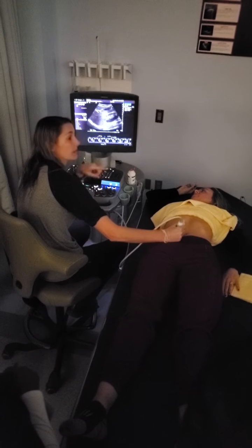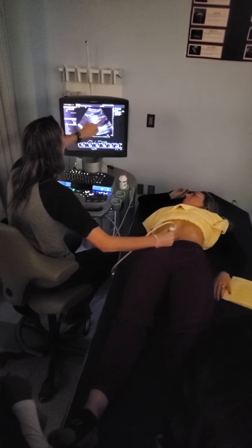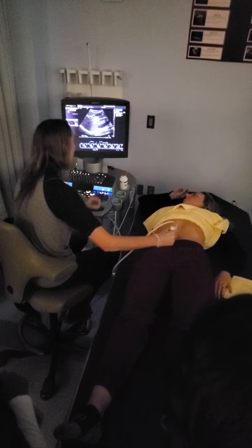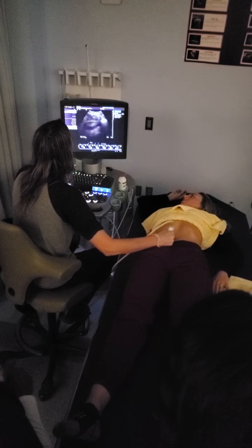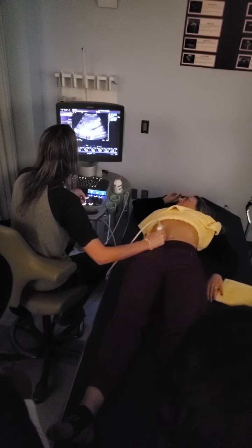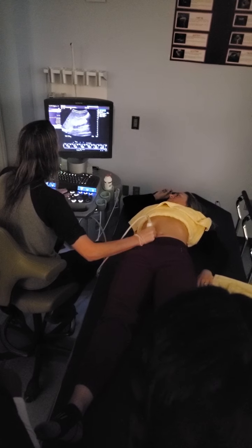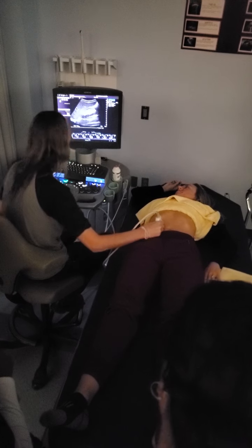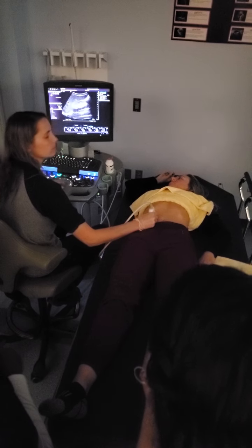Fatty liver. So the diaphragm is going to be our key for the pleural effusion, but this guy we're going to look for fluid in here and do a comparison of echogenicities. The other nice thing about this image is this is where we're going to do our measurement. I want to first show you something. Okay, go ahead, big breath in. And it just so happened when I finish evaluating this right liver lobe inferior, I ended right at the mid-clavicular line. Isn't that amazing? Go ahead, breathe. It's almost like I planned it. So it's going to be the last image of your protocol. We're going to put some calipers on there. So where's my first caliper go?